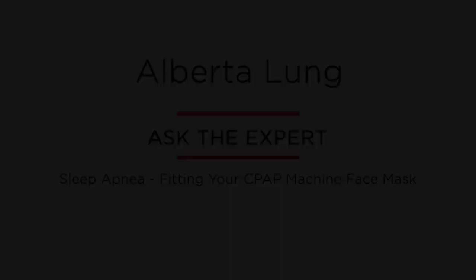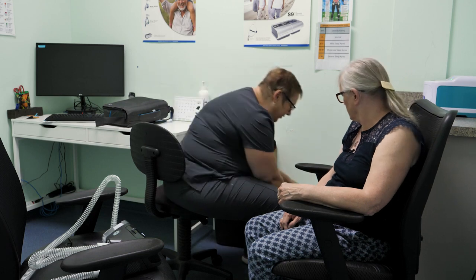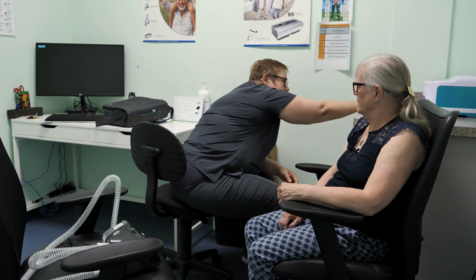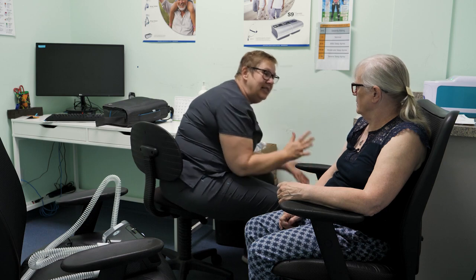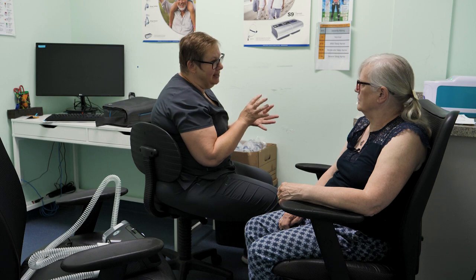So we're going to look at different masks, and you said that you do not move around very much, so we don't need a whole lot of stability, but we do need a full face mask. So we have several different kinds, and we're going to go with this style. And I'm going to try several different styles on you to see what is most comfortable, because the way the pressure is delivered is a little bit different from each mask, and it's really important that you are comfortable during the therapy, otherwise you're not going to wear it.